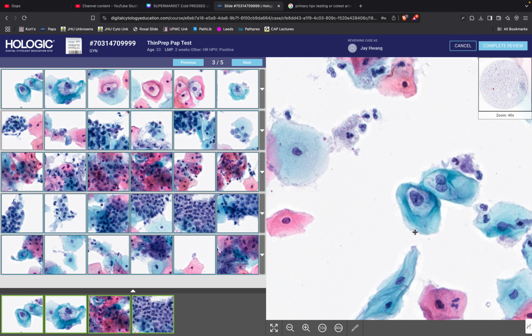So here we have these cells compared to the intermediate cell. These cells are greater in size in nuclei. This is a binuke, that's a sign of dysplasia, and you have this wonderful wire looping. Just by looking at this wonderful wire looping and how crisp it is, I'm at LSIL already.